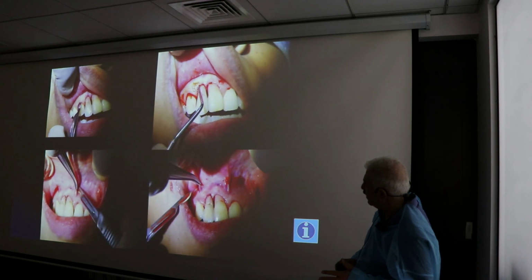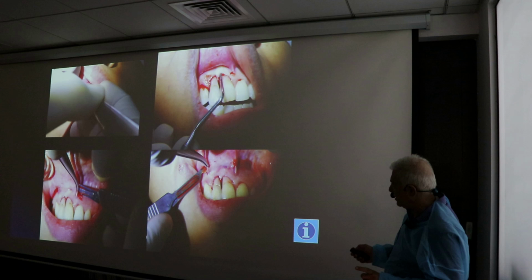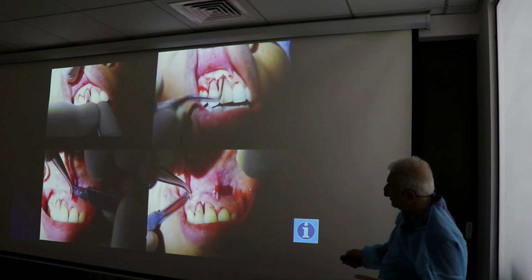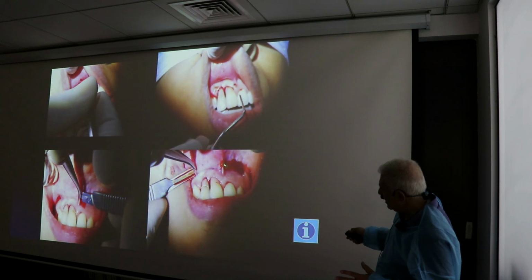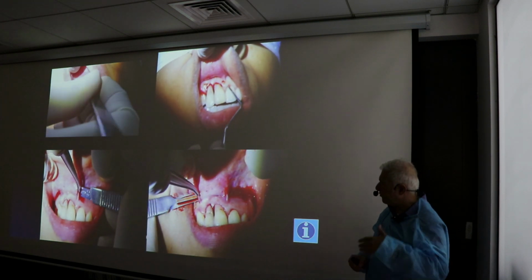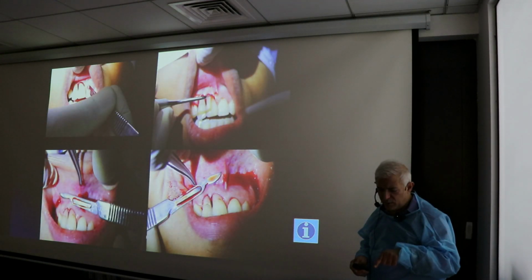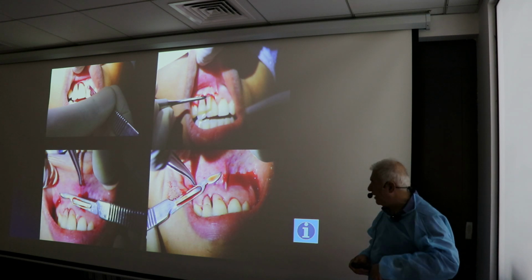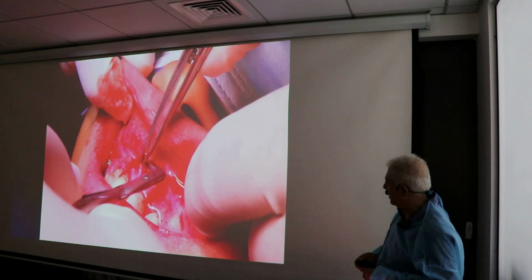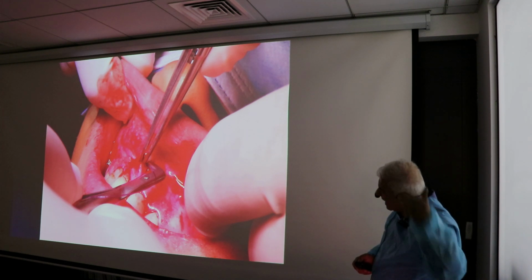Right? So this is how we did the first thickening procedure. We make the full thickness incision in the beginning just to release the soft tissue, and then we make the tunnel from the vestibule area, partial thickness. There is one more video I will show you at the end because it's a long video, probably after my colleague's presentation. It's how we did the last phase.